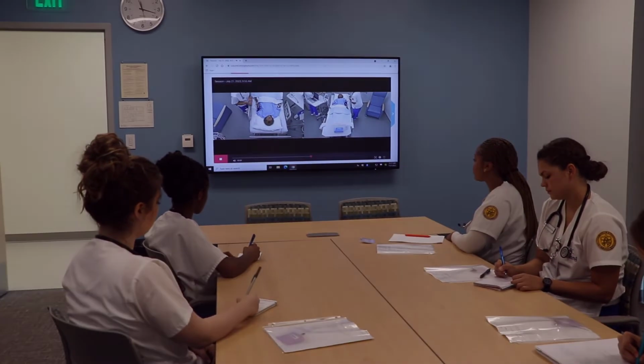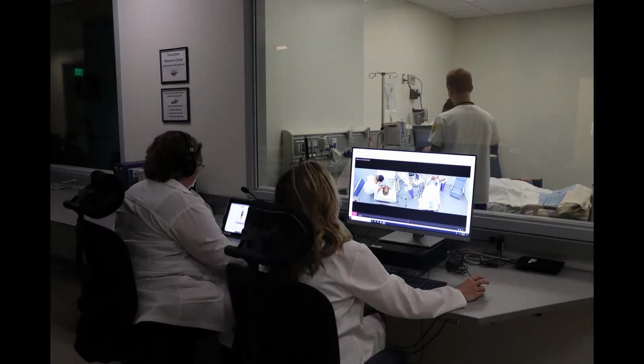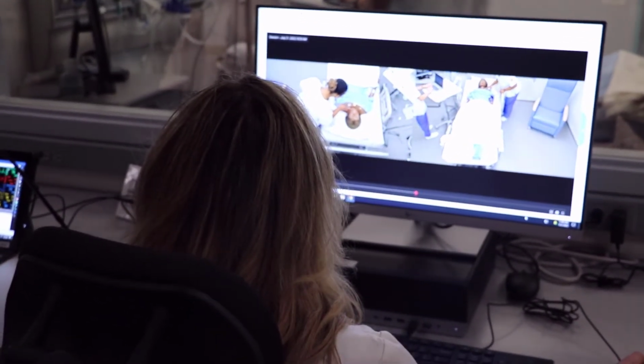The live stream from the patient care room is accessed using a commercial service provided by Laerdal called Beeline via the classroom computer and projected onto a large screen in the debriefing classroom. Once the stream is running, the instructors will go into the control room to operate the mannequin and the simulation progression. The instructors are able to communicate into the patient care room with audio and visual equipment maintained by Beeline.